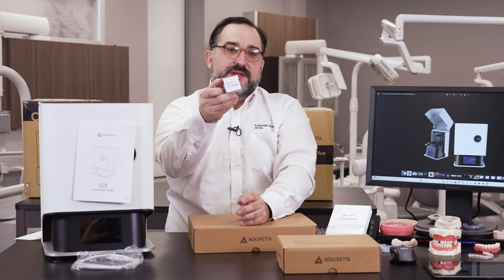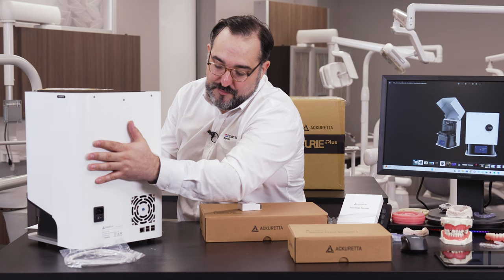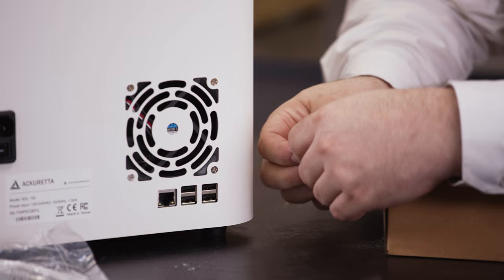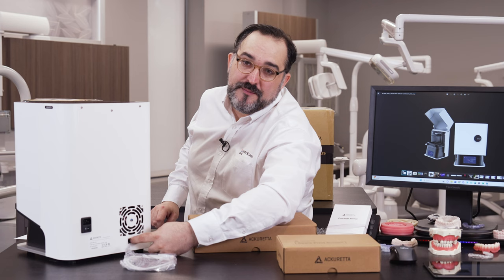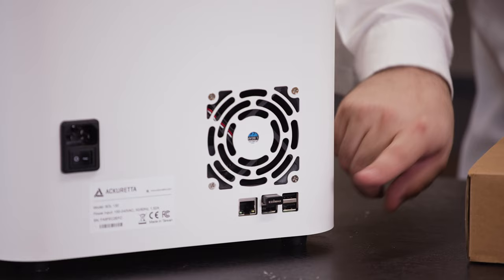The WiFi not being integrated is a little bit of a concern since you have an extra part, but it comes with USB slots in the back of the printer — you just plug the dongle in and it'll work. Or you can directly hook it up to your network using the provided ethernet cable. It's great that they provide both a wireless and a wired option depending on your office setup.